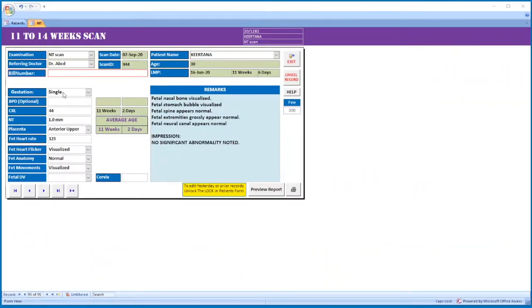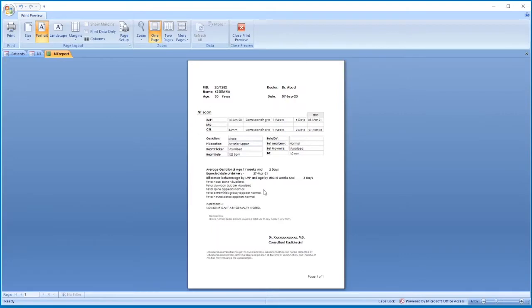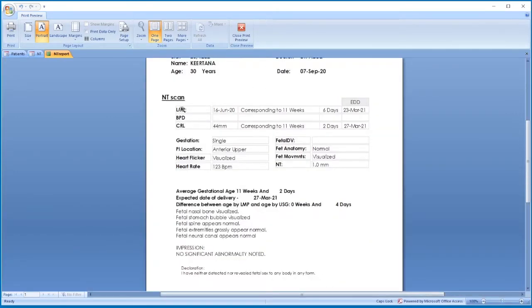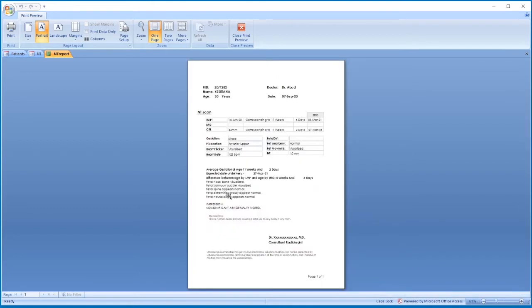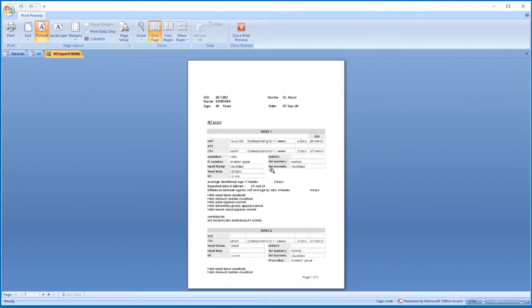If it is an 11 to 14 weeks scan, select the gestation. What you have to enter is only CRL, NT, placental position, fetal heart rate, fetal heart flicker, fetal anatomy, and fetal movements. The template is automatically pasted here. The printout shows patient details, LMP, CRL, corresponding age, EDD, and the template.